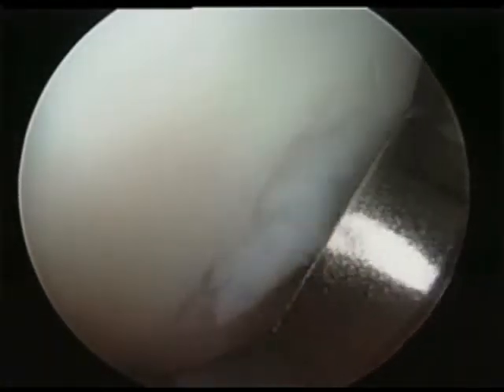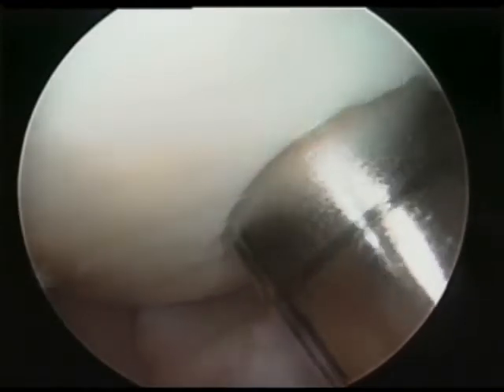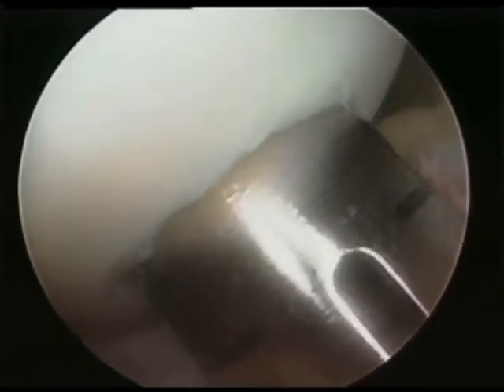This procedure demonstrates osteochondral autograft transplantation using an arthroscopic technique. Osteochondral defects between 1 centimeter and 2.5 centimeters in the weight-bearing part of the knee are preferably treated with osteochondral autograft transfer. This procedure can also be used for the failure of previous microfractured focal cartilage defects. In this case, the medial femoral condyle of the right knee is visualized arthroscopically.